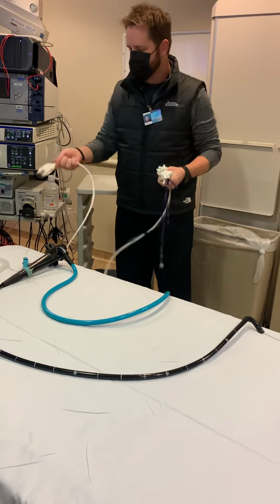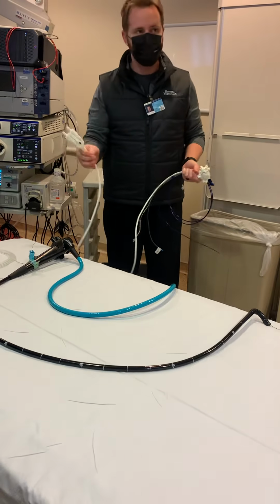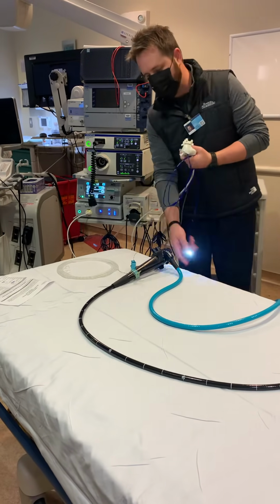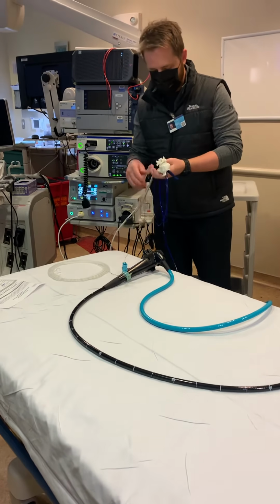On the white portion of the Spyglass catheter, on one side of it is a blue arrow. Blue arrow always facing up, plugs directly into the Spyglass console till it clicks. You'll know that it's on when you see the light. The light will pop on and Spy immediately.